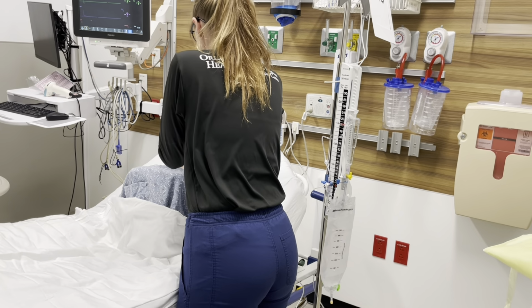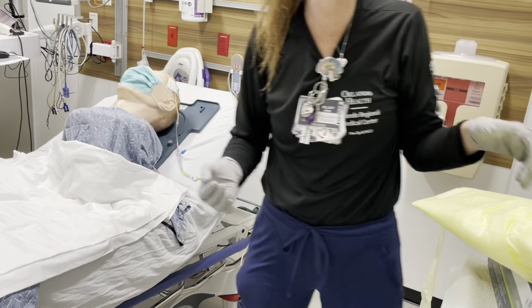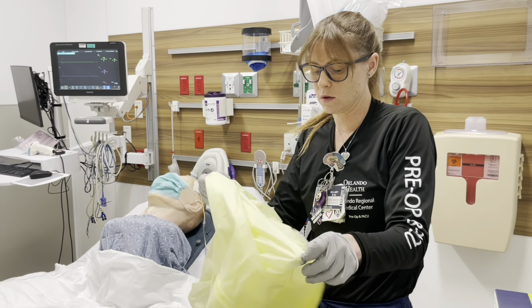And while you're doing all this, again, you can always educate your patient. They may still be asleep from anesthesia. If they're not asleep from anesthesia, let them know what you're doing, so that they're cooperating with you, and you're not just poking around with them and they're like, what are you doing?